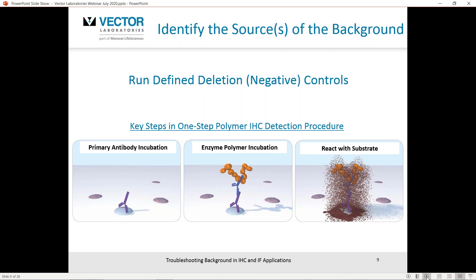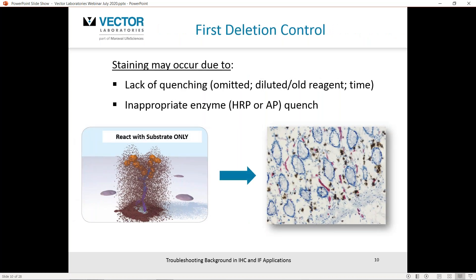If you are encountering background, identify the source by running your defined deletion controls. Here is a schematic of a one-step polymer immunohistochemistry detection procedure: primary antibody, followed by your enzyme polymer, then reacted with the enzyme substrate. The first deletion control — omitting both primary and secondary detection reagents — is to apply just the substrate alone and see if there's any color development.